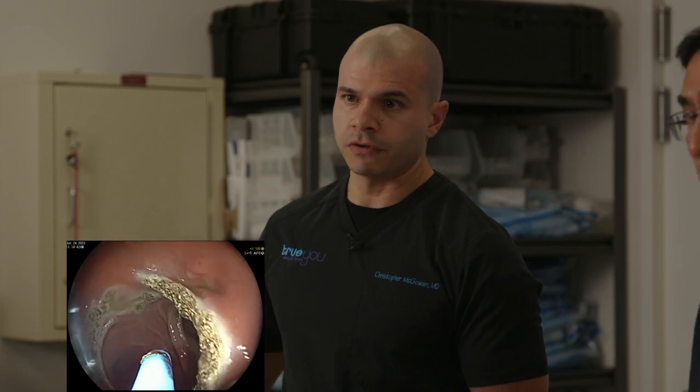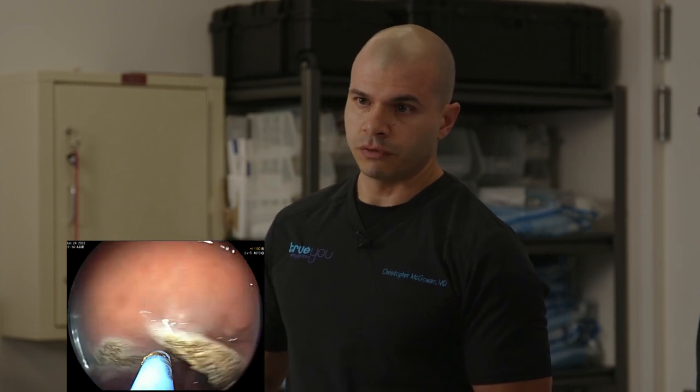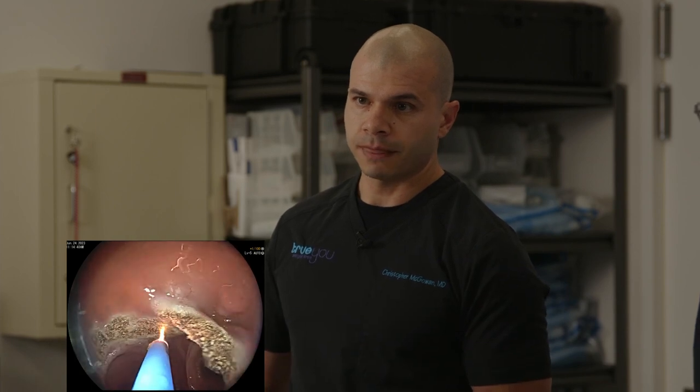What I'll do is make my way around a few times, aiming for about a centimeter or more of a treated rim around this anastomosis. We just want to get full coverage. This also helps to create a bit of a lip or ridge that will then make our suturing a bit easier. And if we have any questions, I can start now.